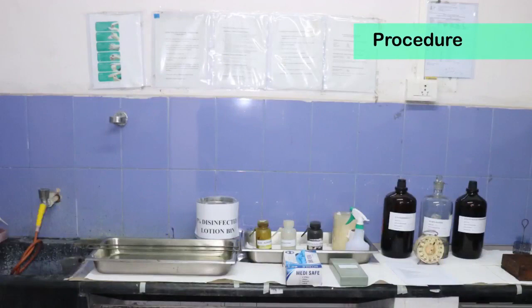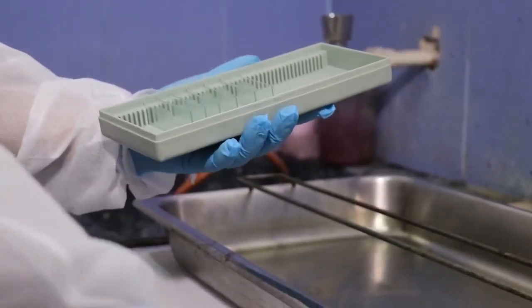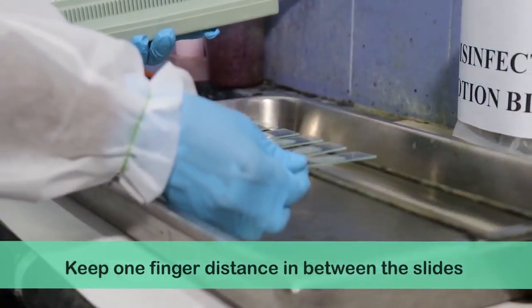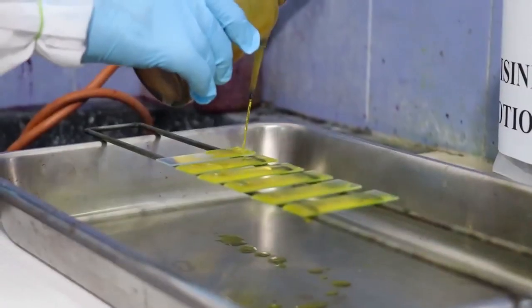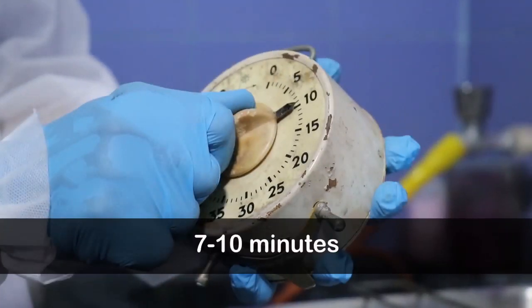Staining should be carried out in a designated area. First, place the slides on the staining rack over a sink. Do not place slides too close to each other. Next, pour Auramine O in a manner that the entire slide is covered. Leave the Auramine O on the slides for 7 to 10 minutes.